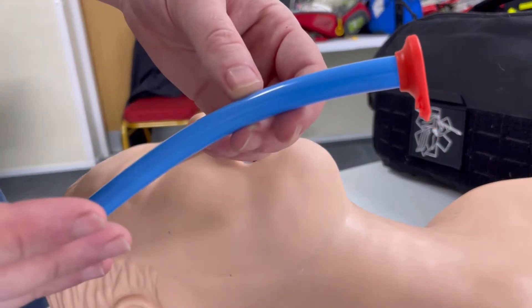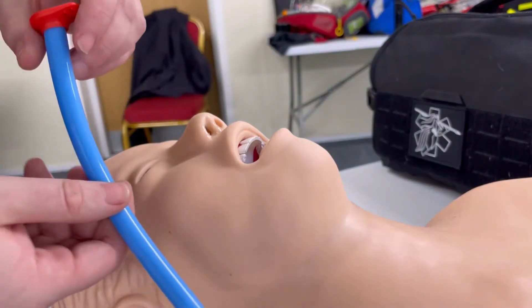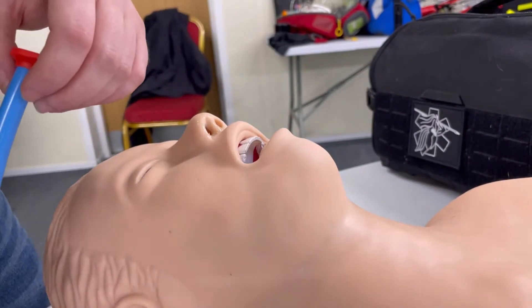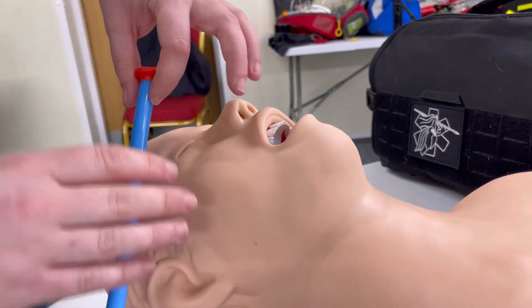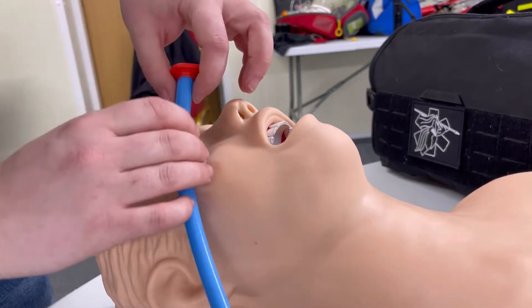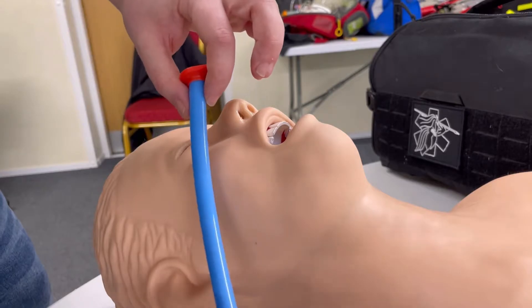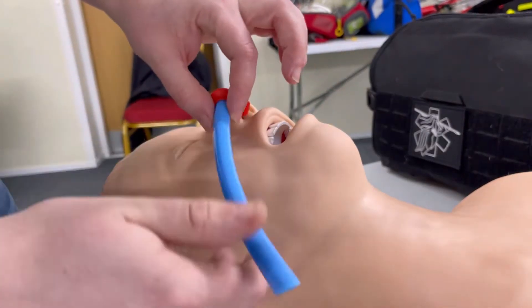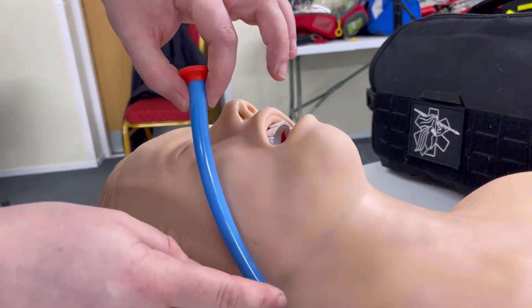What this is is a long plastic tube that we pass through the patient's nose, and it sits around the back of the throat area. The intention for this is that it will basically maintain a patent airway. So if there's any swelling or collapse that occurs along the length of the tube on the inside, we've still got a hollow airway that connects from the patient out to the outside world — a patent airway.